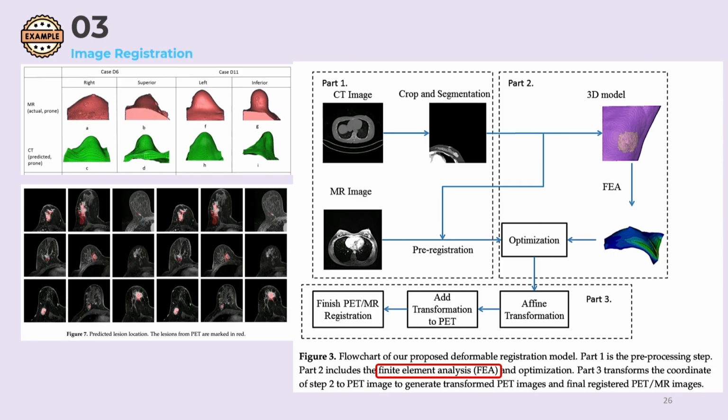So now I'm going to show you my earlier study, which uses biomechanical factors to predict how the breast tissue, and particularly the lesions, will deform and move in location when the posture is different. And we found very satisfactory results through this model.